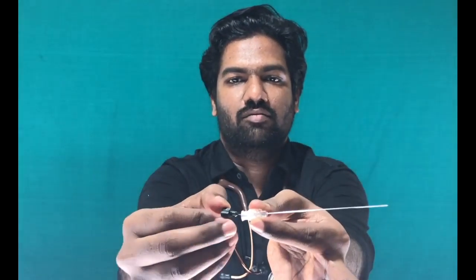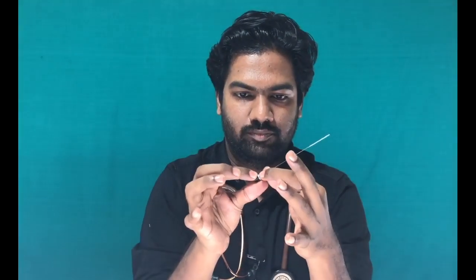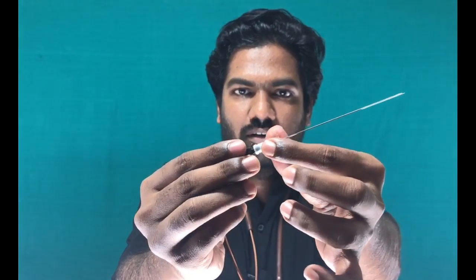Okay, this is just to keep the stylet in the center. Now, whatever I had bent like this, I'll try to put there like this. It will get fixed properly inside. Now you want to know about this. This is the needle, and this is the stylet which I remove. If I remove this, you can see a small projection here. If I pull this, you see it has become outside. Can you see this? This small projection will go and lock itself properly into this small groove here. It is nothing, it is just to keep the stylet in situ.